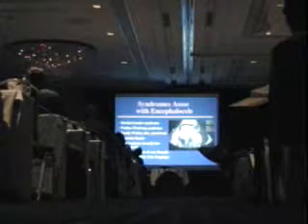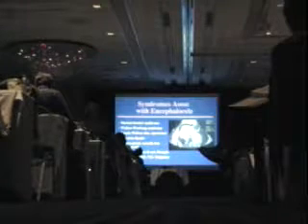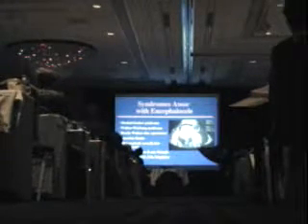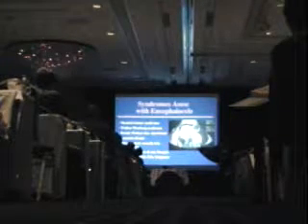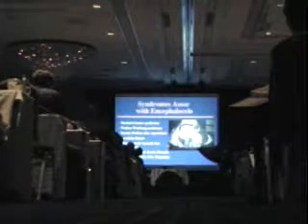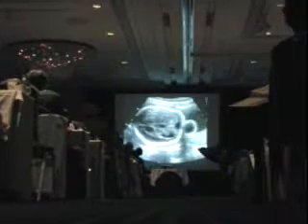The head can be disrupted by amniotic bands. A lot of times you will get microcephaly when you have an encephalocele, because if some of the brain is outside of the head, then the head itself is going to be small. It's not going to be large enough. And then you have some clefts, facial clefts that are associated with encephaloceles as well.